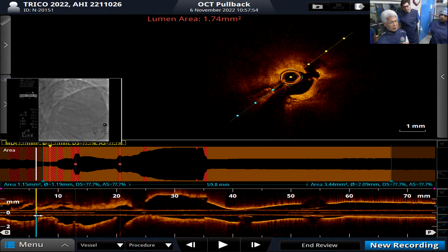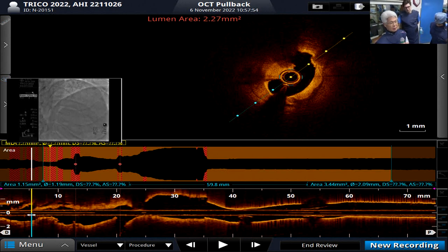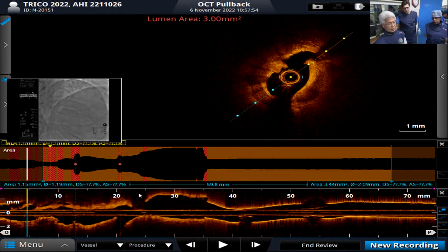Calcium is not actually surface. It's not severe enough. Yeah, it's not surface calcium. It's deep. I mean, here you have a pretty good arc actually. Yeah, I agree. Here it's pretty good, but it's deep. And also, with some distance from the guide wire to this position, the rotablator cannot touch this calcium. I think here it's quite deep.